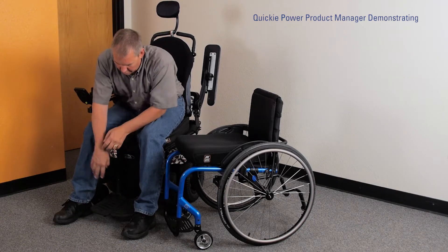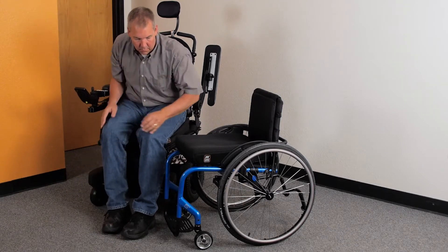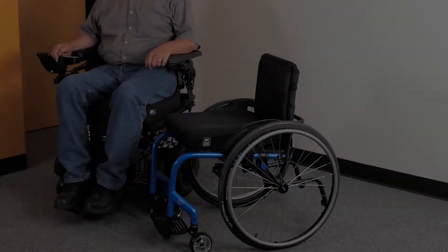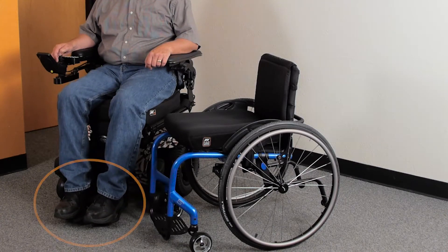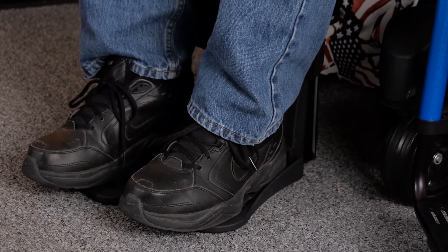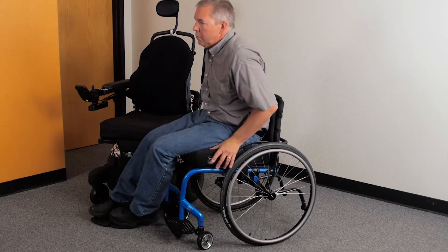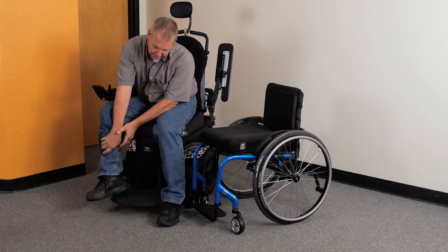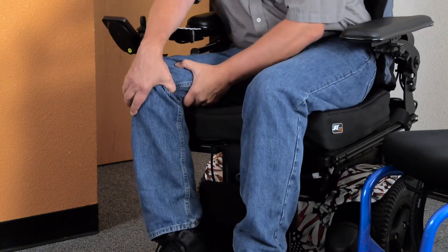For users who frequently execute chair transfers, the Quickie design is very helpful. In a transfer, users usually move the legrest out of the way and then slide up and out of the chair onto a seat, bed, or other surface. With the Quickie Power Center Mount Legrest System, users have the option, when activated, to move the footplate to the floor using the independent footrest actuator. This technique maintains a stable platform for the feet, which simplifies the overall transfer process. Users don't have to worry about bending over and falling forward or moving their legs sideways to pull up the footplates.